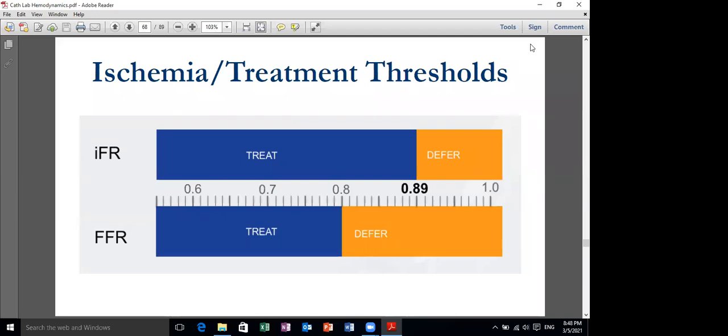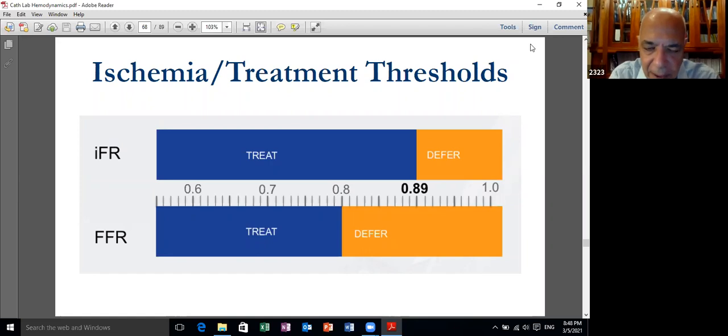The question asks: during measuring the pressure gradient, can we apply pullback, or must we calculate the pressure gradient with simultaneous pressures? It depends. If you are in a high pressure system, for example measuring the pressure across the aortic valve, the pressure gradient will be high, and therefore a pullback will be satisfactory, provided that you are using a catheter with an end hole, not side holes. It is not a pigtail catheter with part of it in the left ventricle and part in the aorta.